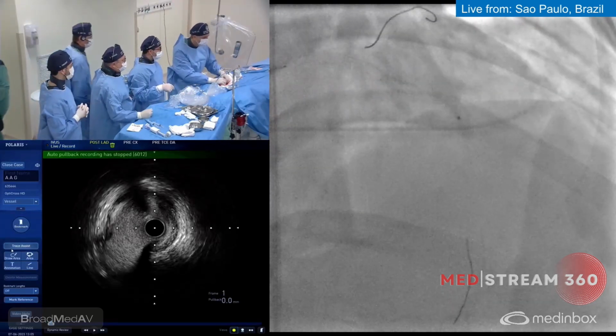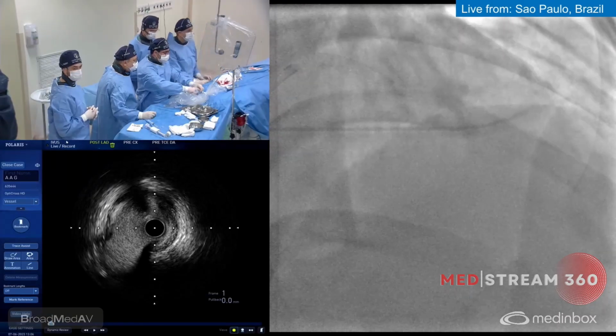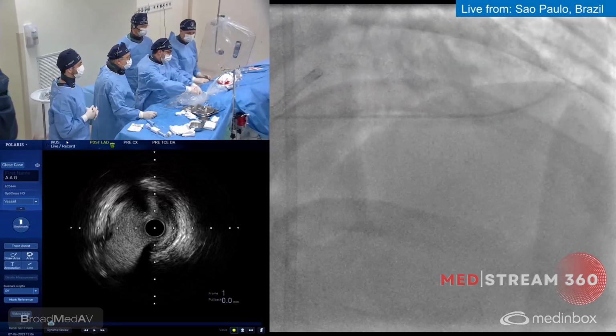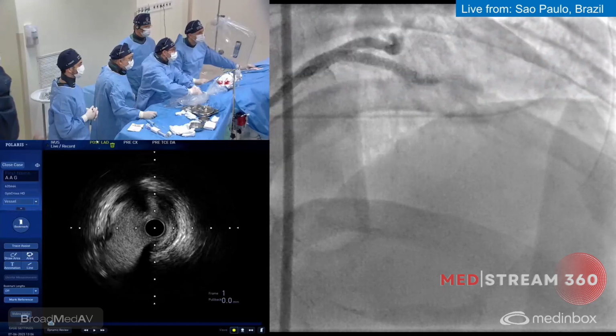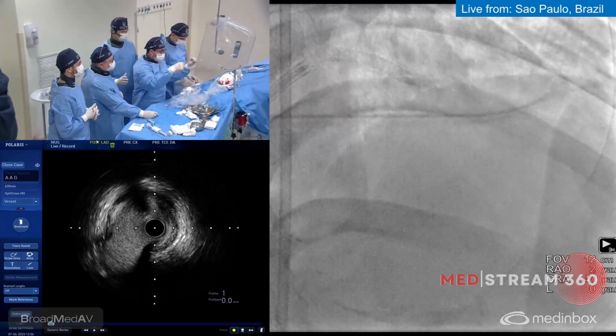That's great. Great results. We don't feel we should do anything else here in the circumflex, and I'm just going to do the final control angios. Let's do the angio. Inject. Okay, great. Absolutely great.